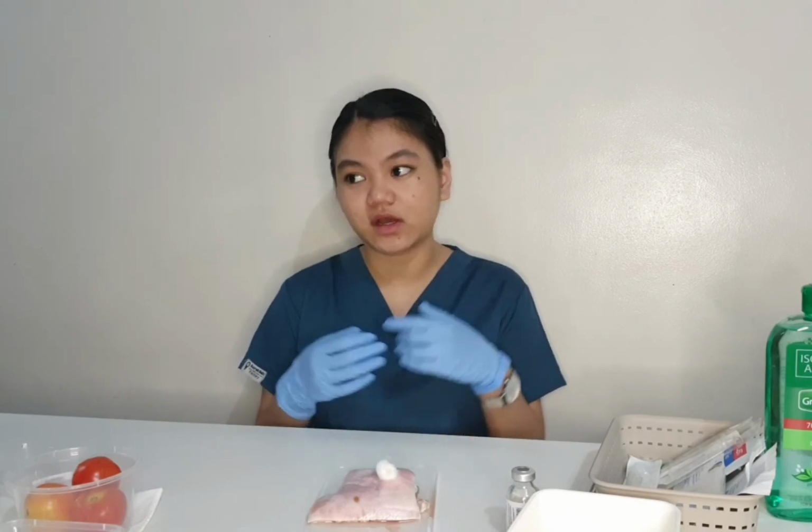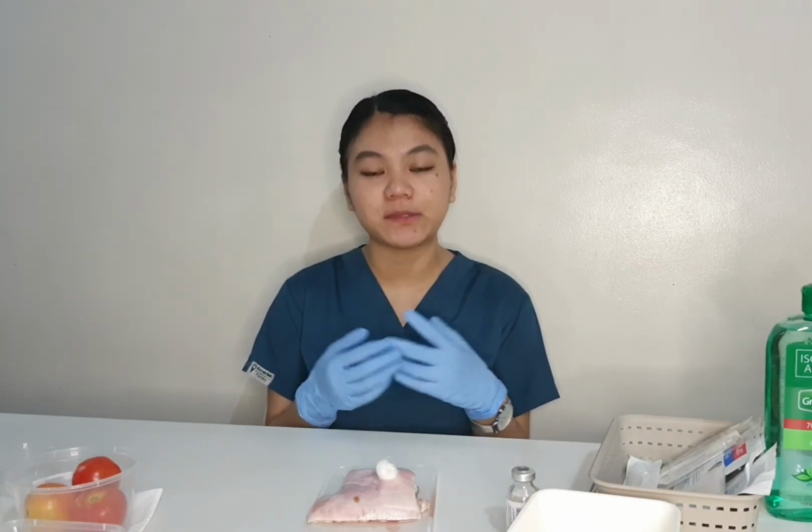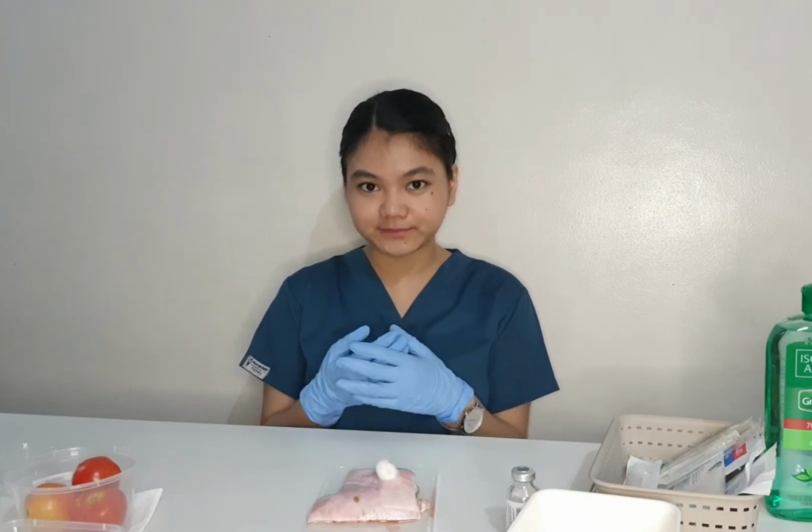After that, we have to check for any reaction or allergy from the patient. But of course, before injecting the medication, you have to make sure that the patient has no allergy with the medication that you will be injecting to him or to her. Okay, so for us to make sure that there is no negative reaction to the patient's body, we have to wait a little for any reaction of the patient.